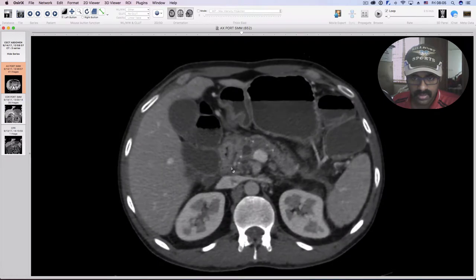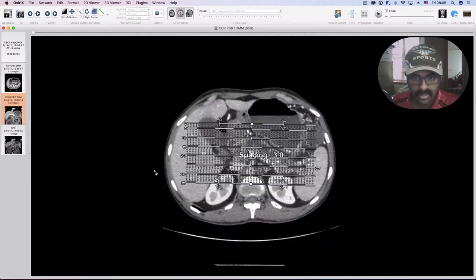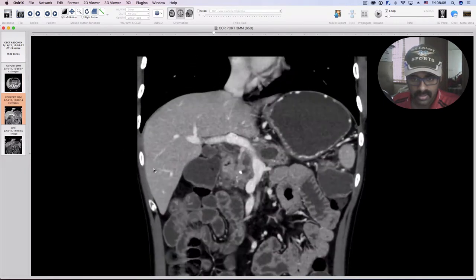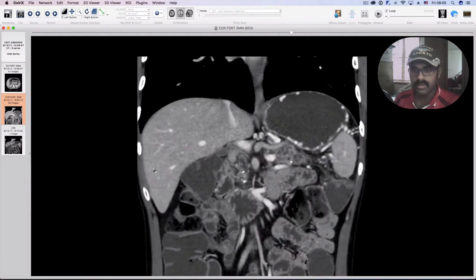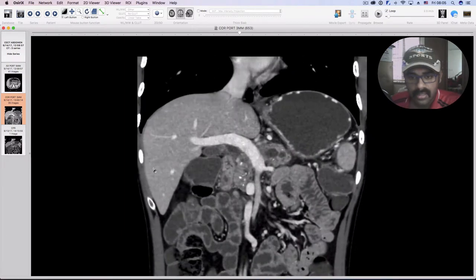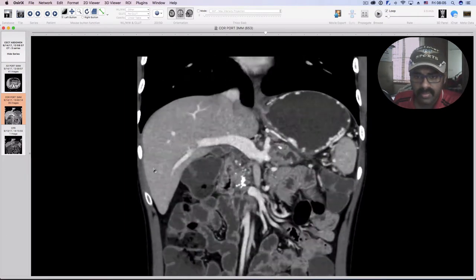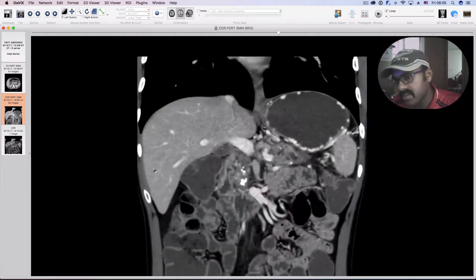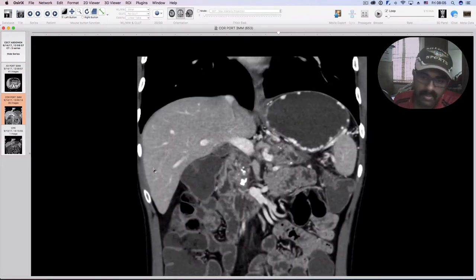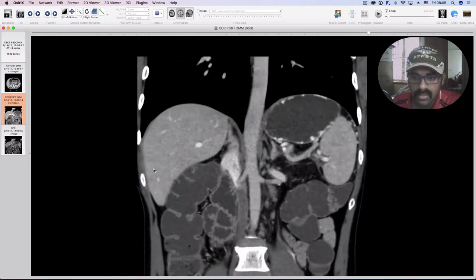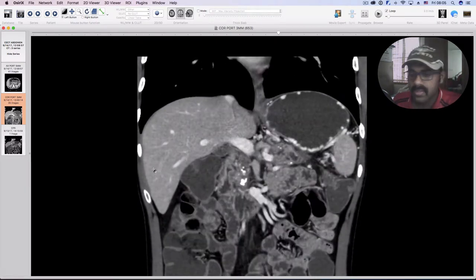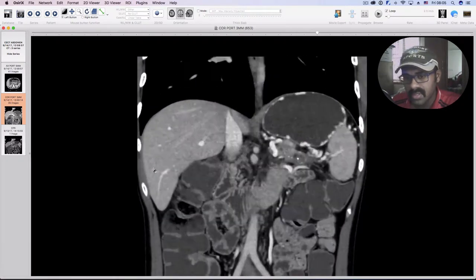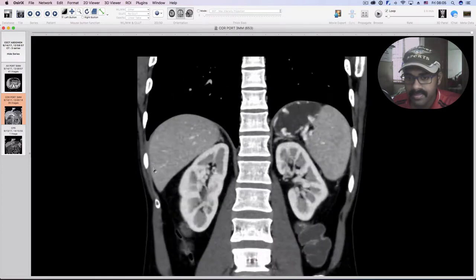This is a case that is typical of chronic calcific pancreatitis. Over a period of time, there are multiple calcific deposits seen in the pancreas and a generalized decrease in volume of the pancreas, eventually leaving only a remnant ghost pancreas.